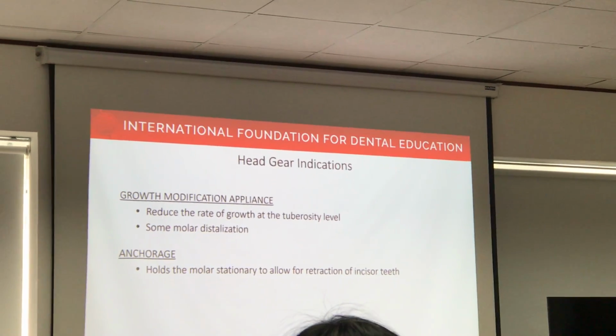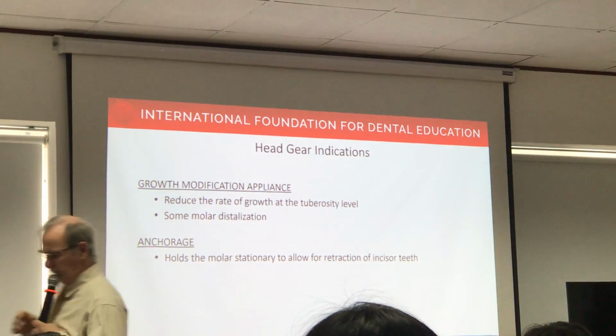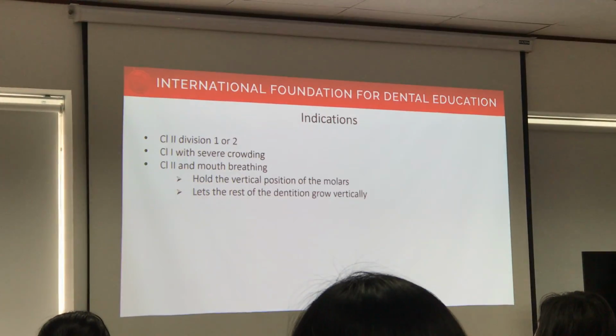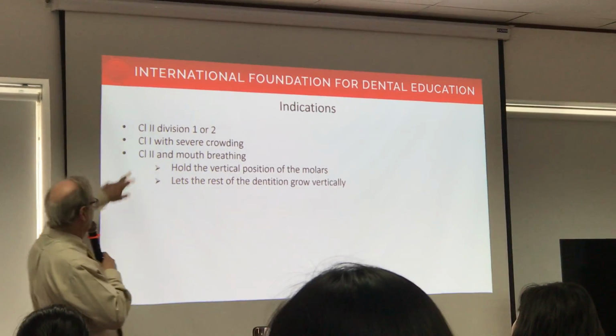Moving on to the headgear, which is an old technology, but it doesn't matter. At the end of the day, it does what it's supposed to do. Okay, so indication, class 2, division 1.